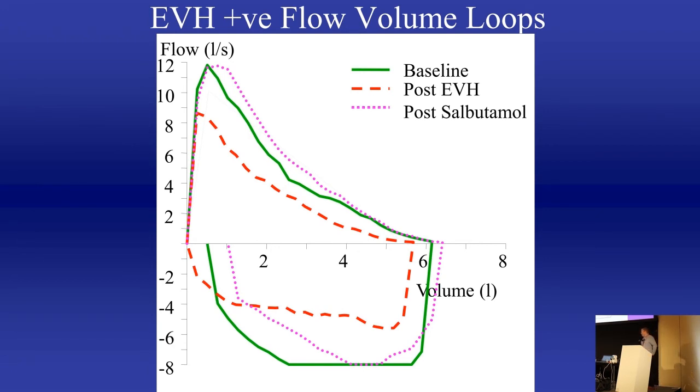I don't know how much time we've got on. How long have we got left until we need to do a spirometry? About a minute. Okay. The first 3 minutes are over for the first testing. So at least 3 minutes prior, you can expect the first reaction, right?